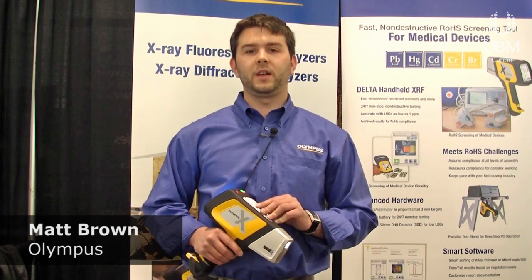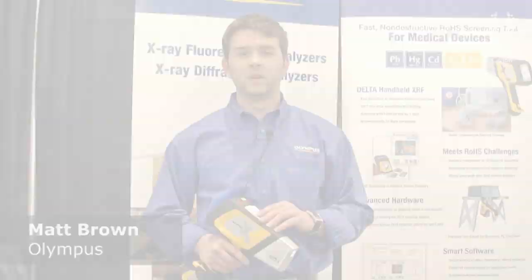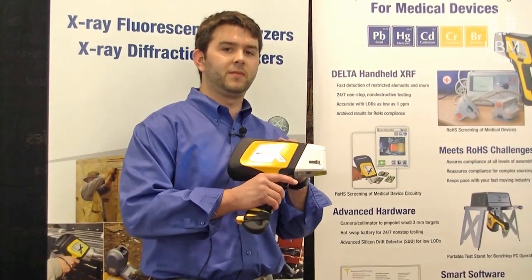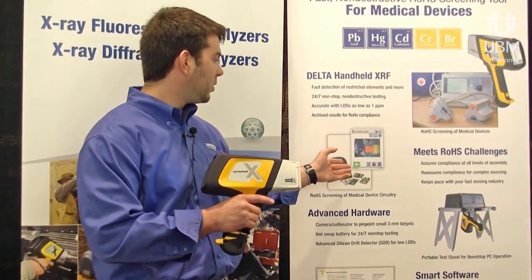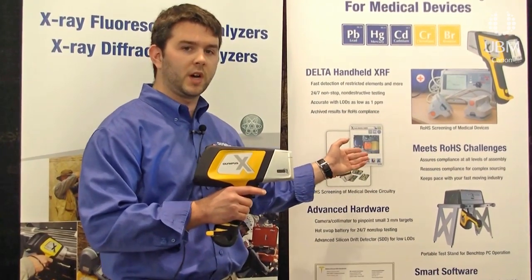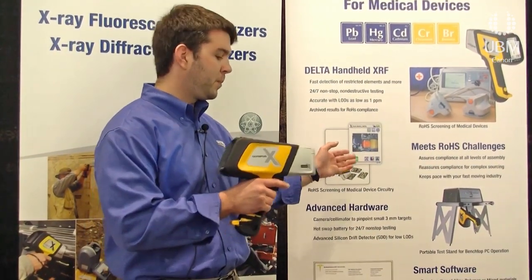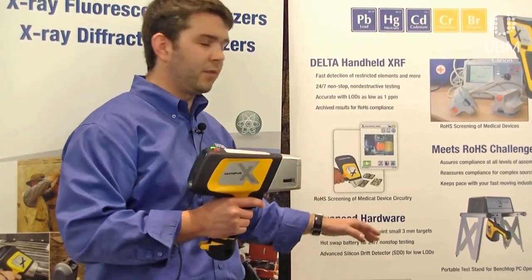What the Delta Handheld XRF will do is identify contaminant metals or elements in solder. For the RoHS regulation coming up next year for medical devices, this will detect the presence or non-presence of lead in the solder. To use it, you simply take a sample — in this case we have a PCB board — point it at the sample, analyze, and get your results.